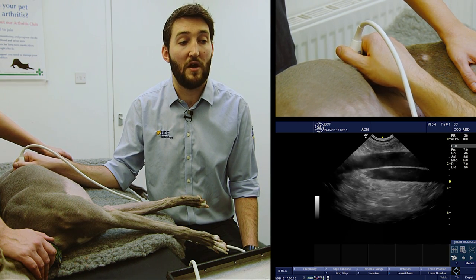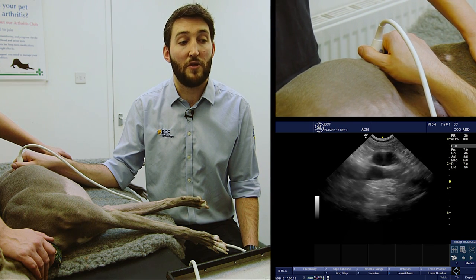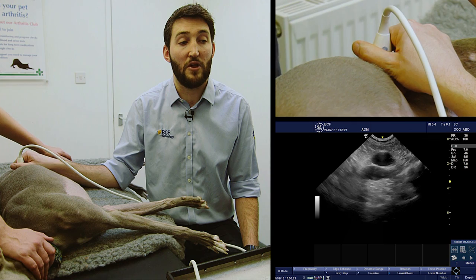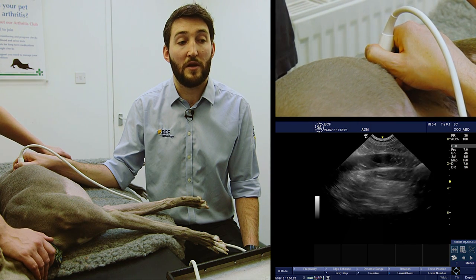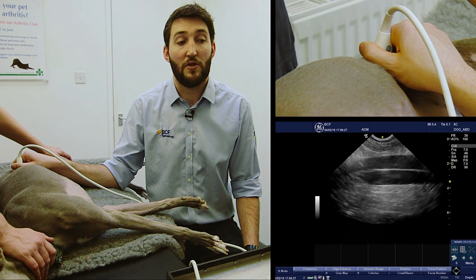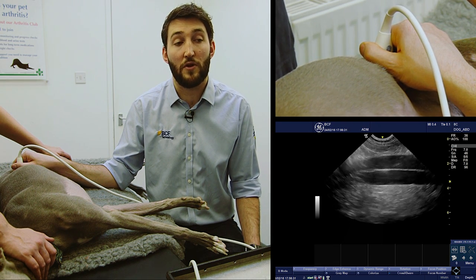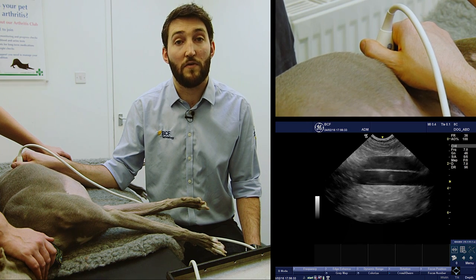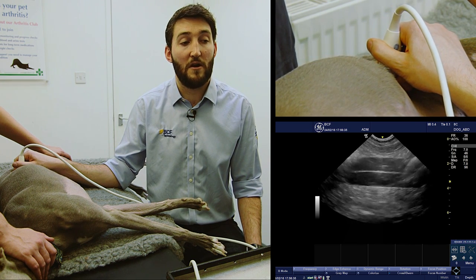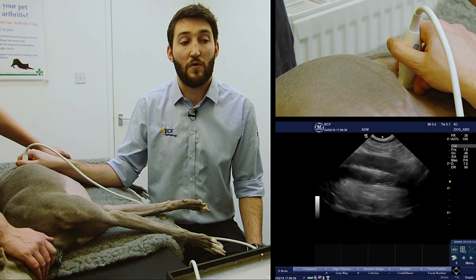So we've found our aorta and our vena cava. What we're going to do then is make minor adjustments to the rotation of our probe — you can see how I can either foreshorten those vessels or get them to elongate out just by making rotational movements. We're just going to ensure that we're doing a longitudinal section of those vessels, and then we're just going to slide our probe along the body wall to trace them all the way to their caudal extent.